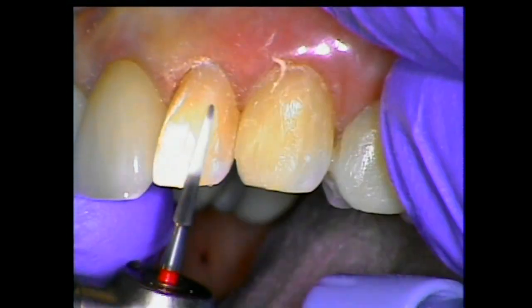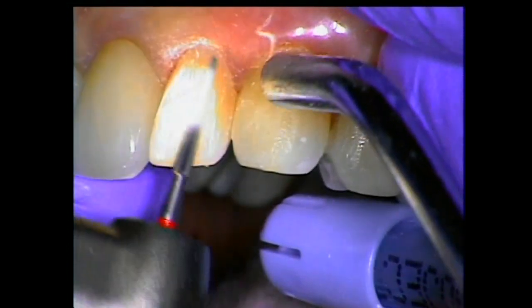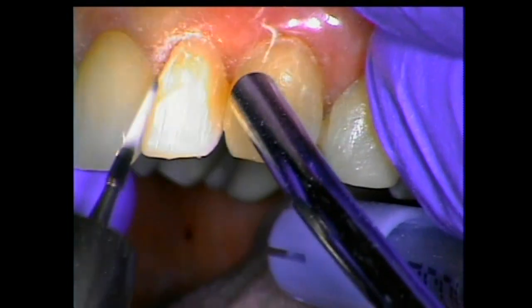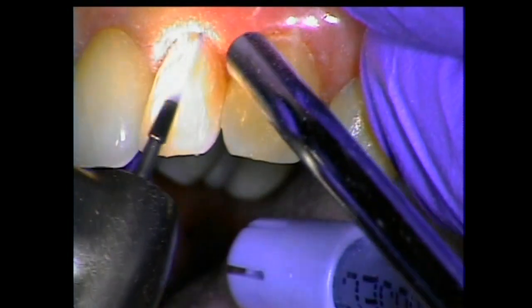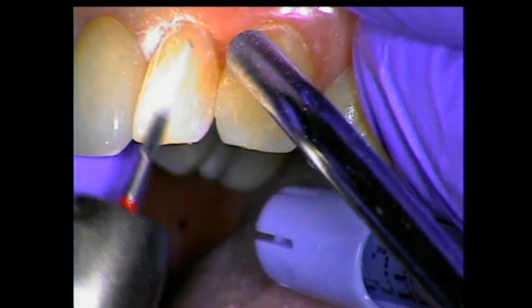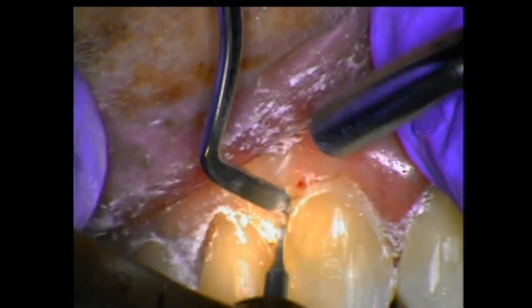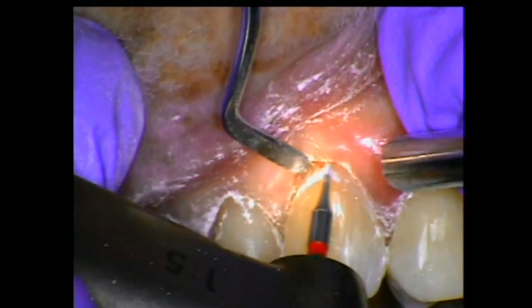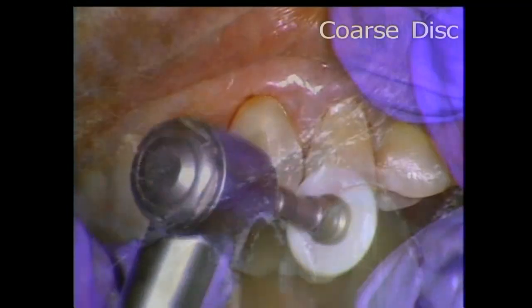I rotate the bur in my hand following the convexity of the tooth surface, wiping out any margin that I might have. As I come towards the gingival, you'll notice I'll cut on the gingival tip of this bur. That's the way we keep maintaining the contours of these teeth. If you're familiar with carbide burs at all, they have a tendency to chatter and break material off, whereas this cuts finely and you get a perfect margin.